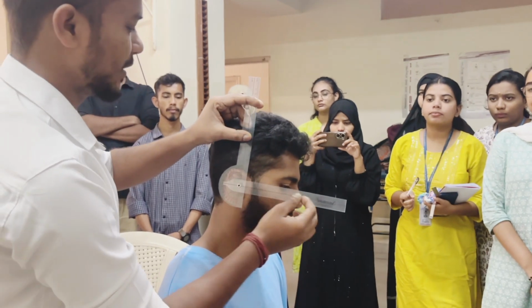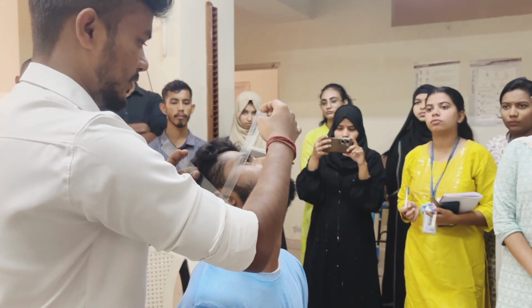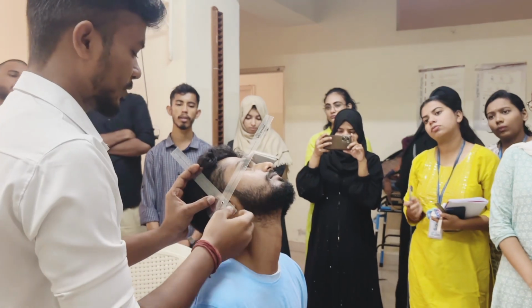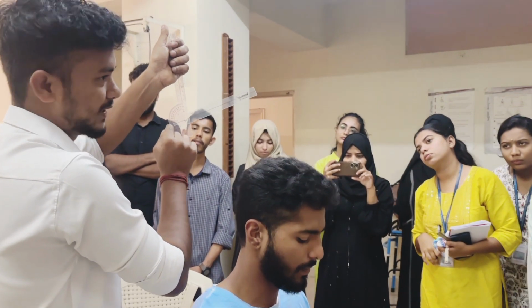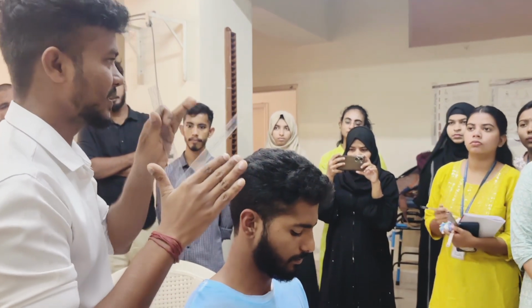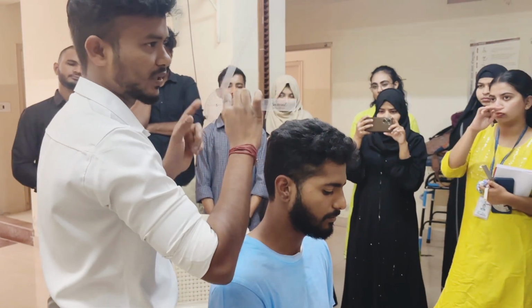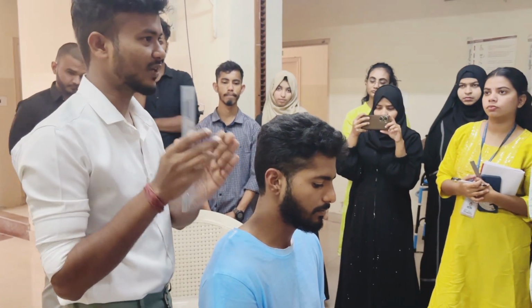Then I will ask the patient to do extension. When the patient does extension, the movable arm is exactly at the base of the nose. Relax. Here I got a measurement from 90 degrees to 70 degrees, so that means 20 degrees. It depends on the patient. From the neutral position, how much he did extension, that we measure. The only point is where to keep the fulcrum, the movable arm and the stable arm. This is flexion and extension.